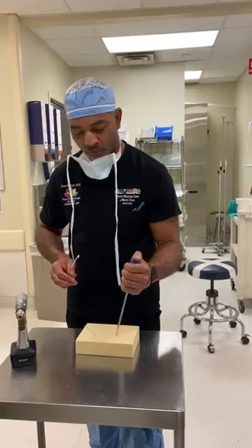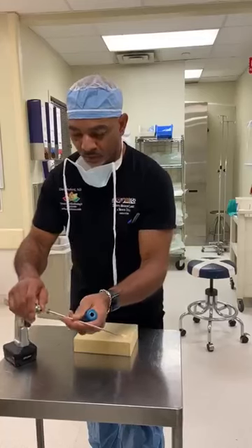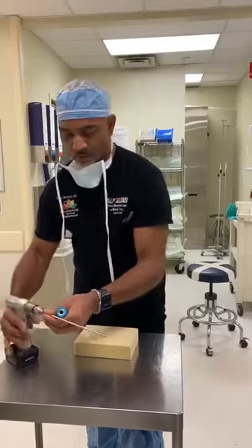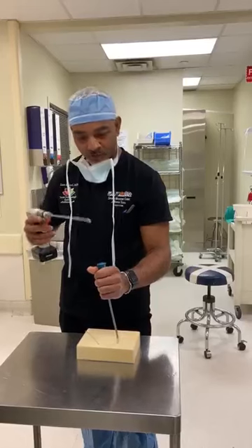Most of the surgeons watching this are familiar with having a guide for a drill. This just pops into the drill — here we go, spin it, it works. Here's the guide. Notice the anchors on the drill.